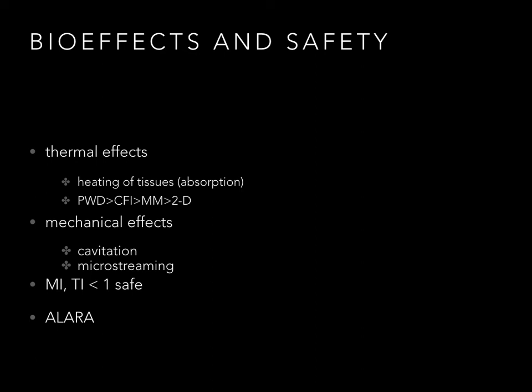To date, there have been no known adverse biological effects of diagnostic ultrasound. However, the potential for bioeffects does exist. Bioeffects refers to the potentially adverse effects in tissue, and it's categorized as thermal effects and mechanical effects.